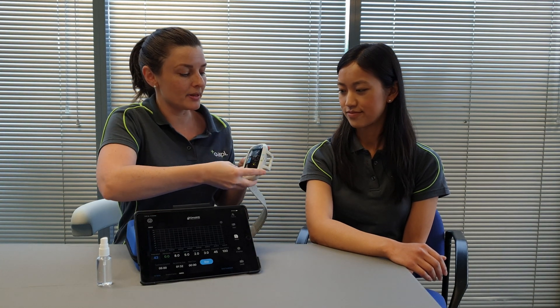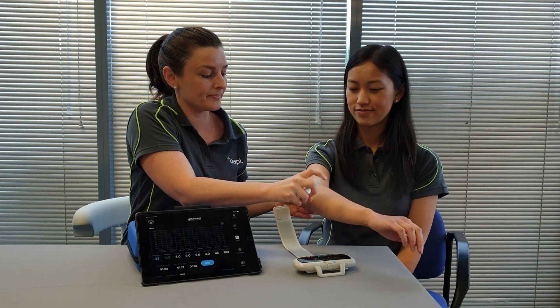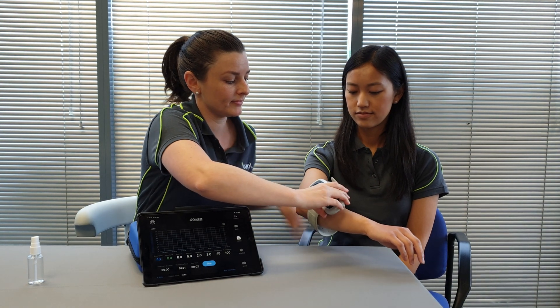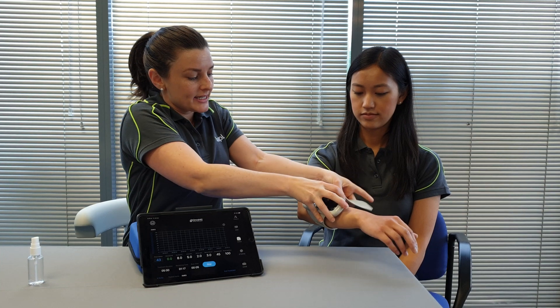We're going to apply this now to our patient using plenty of water onto the arm, and we'll place it just here below the elbow.